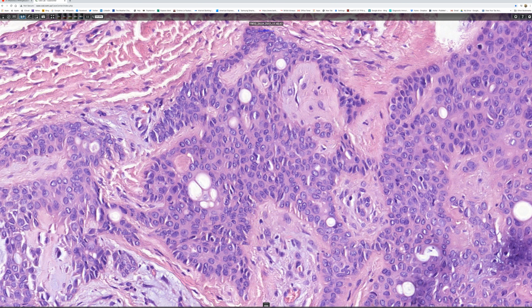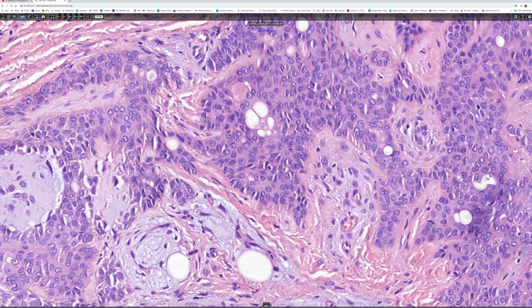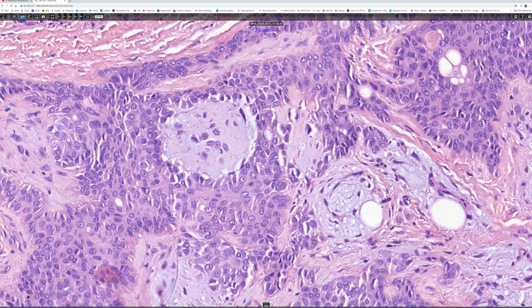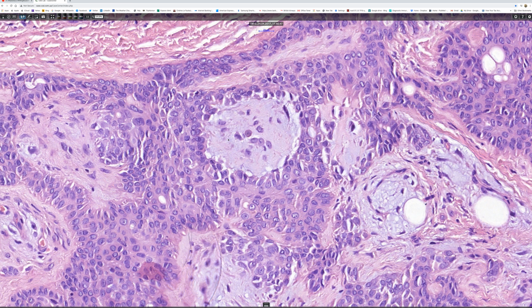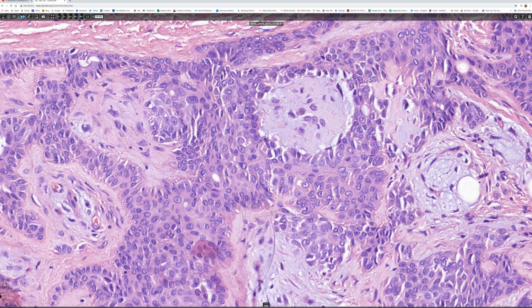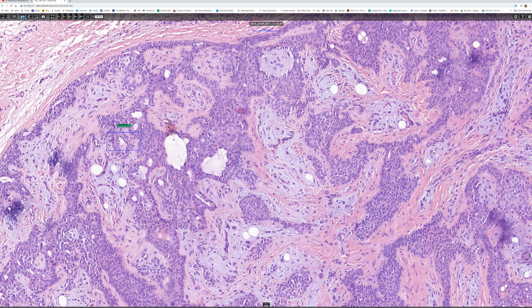And there you see typical foci of ductal differentiation, in which there is a well-formed hyaline, almost refractile cuticle. So those are the small ducts. Sometimes these represent intracytoplasmic lumina, which I think is probably what we're seeing here with these smaller ones. So that's ductal differentiation, and there's a bit of stromal component. I suppose it's myxoid. You could maybe wonder whether it's going towards chondroid. I'm not really convinced. And here we have tubulo-alveolar differentiation.